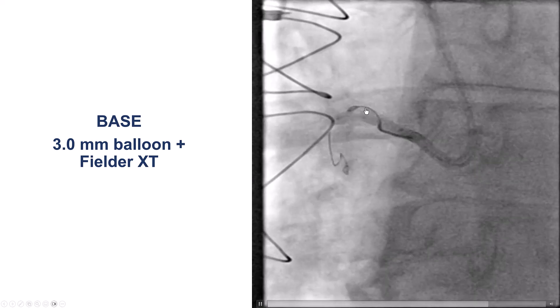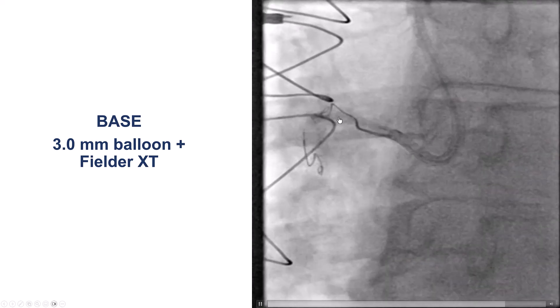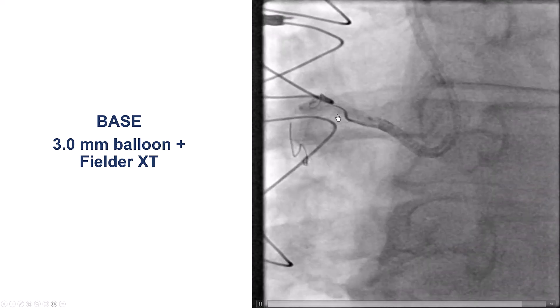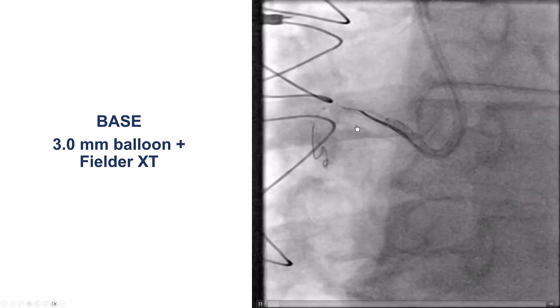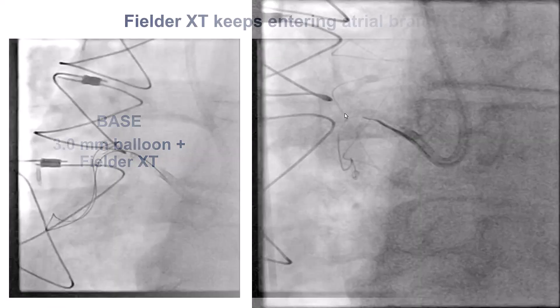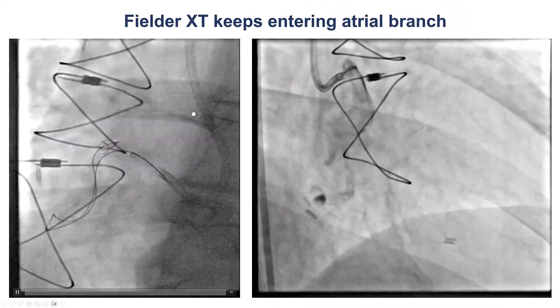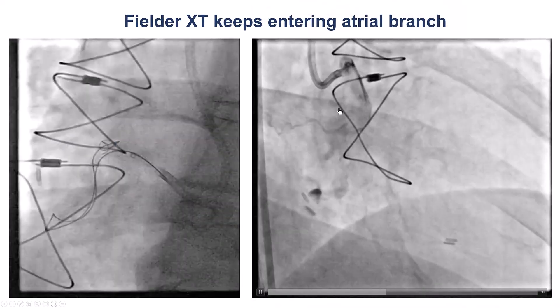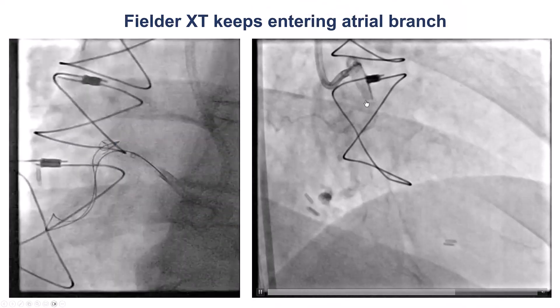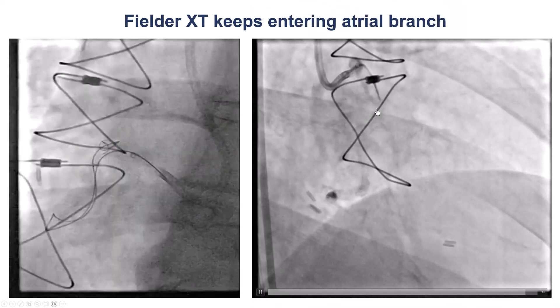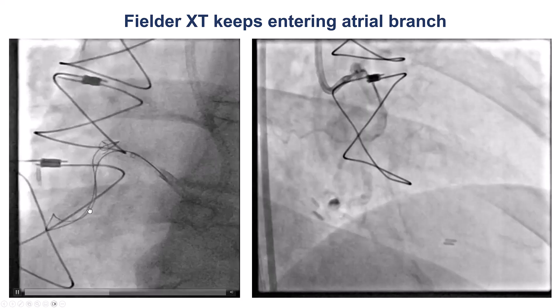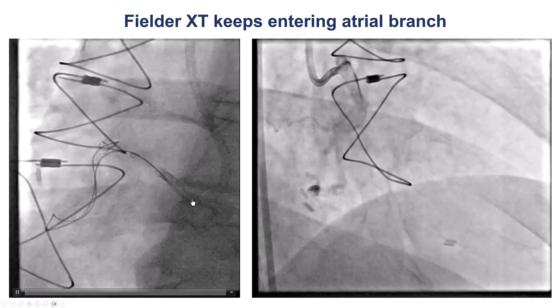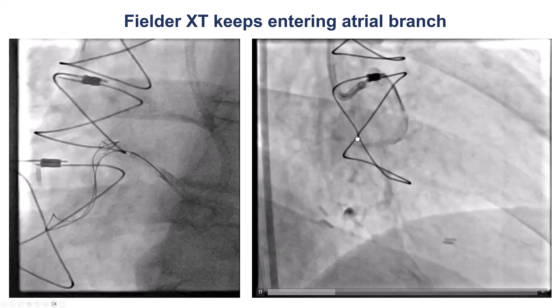Because we were into the intraplaque space and with the heavy calcium, it was very hard to advance equipment. The Fielder XT did progress; however, unfortunately, it kept entering into an atrial branch.